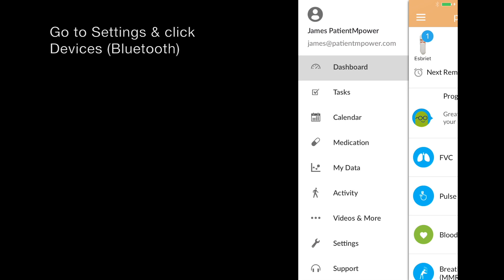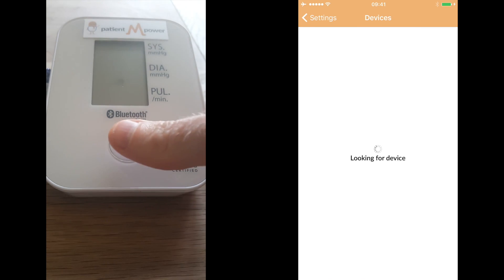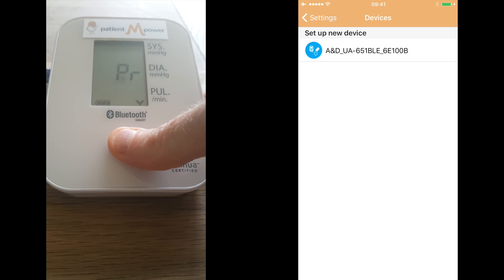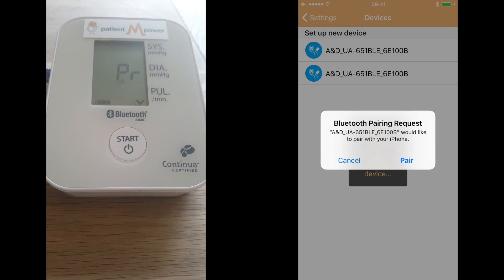To pair your blood pressure monitor, go to the settings section and then click Devices Bluetooth. Then press and hold the Start button on your blood pressure monitor until PR appears on the screen. Then press A&D on your app and click Pair.